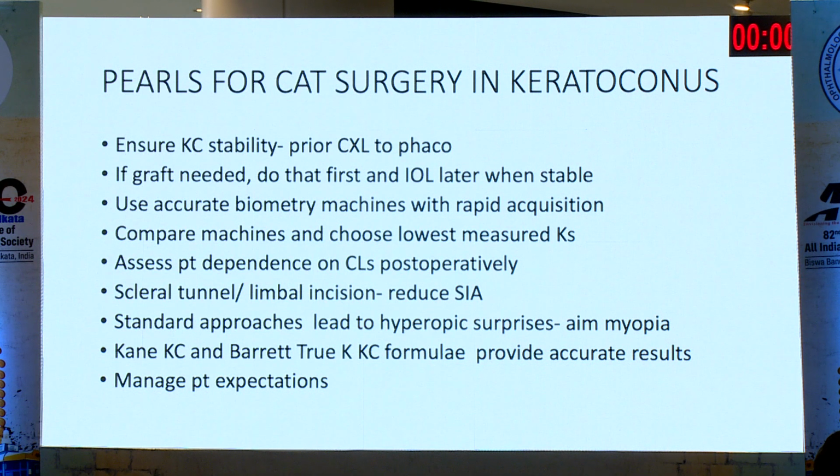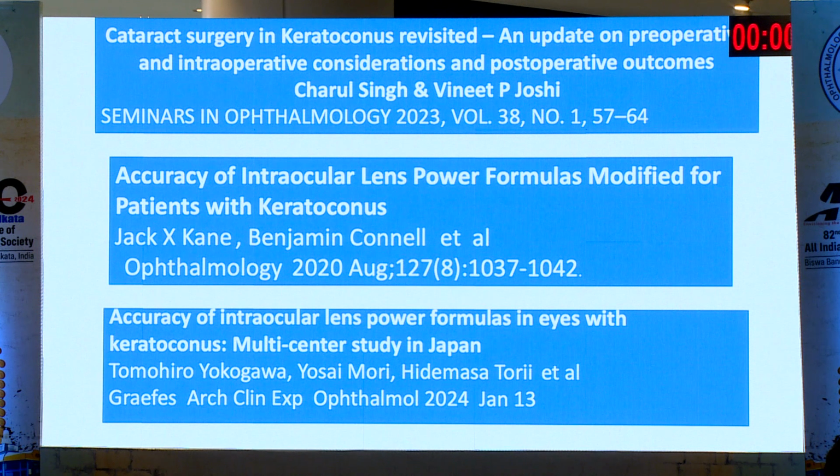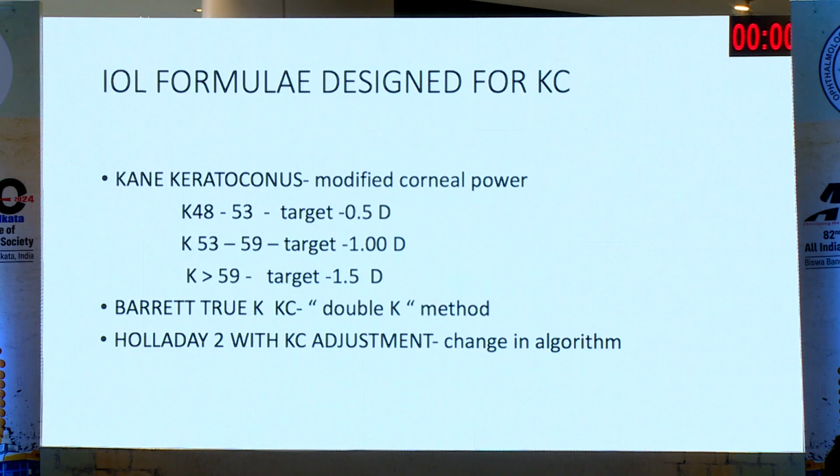The Kane keratoconus formula and the Barrett True K KC provide accurate results, and you need to manage the patient expectations. So the surgical planning needs a multifaceted approach, and there are a few reports in the literature.